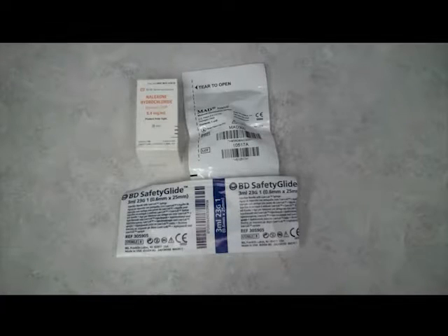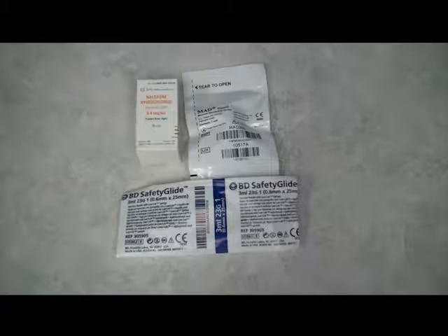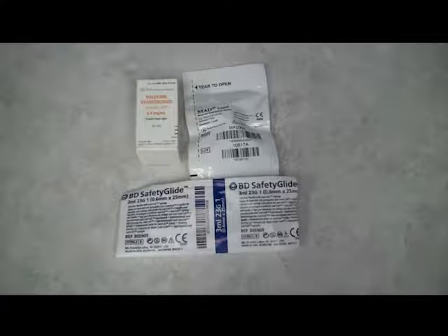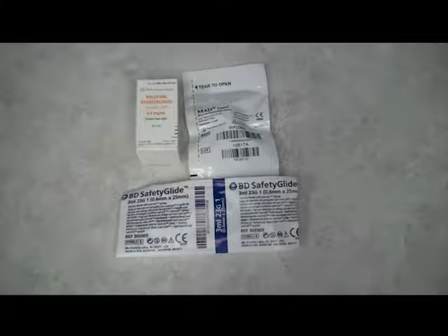Check your protocols for approved intranasal medications in your system. As you can see, we have a box of Narcan, a mucosal atomization device, and a syringe. We will also want to make sure we have our approved BSI and access to medical control. Local protocols require medical direction contact before an EMT can administer Narcan. Once the order from the physician has been received, you can move on to the next step.